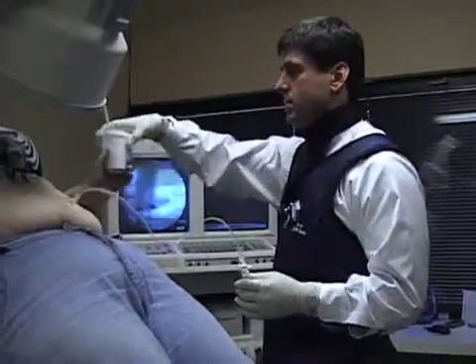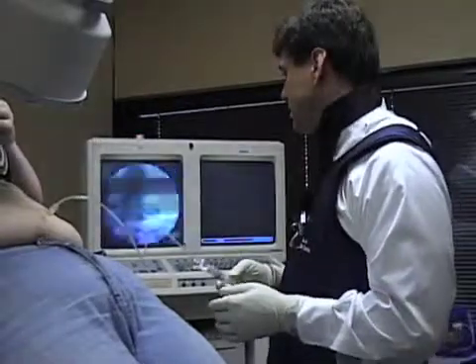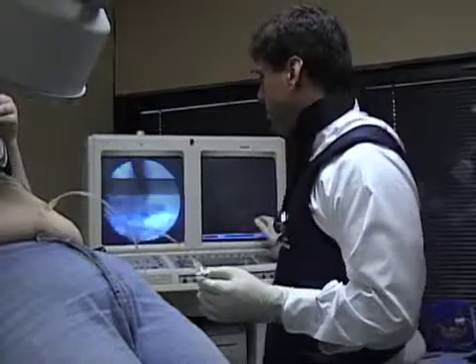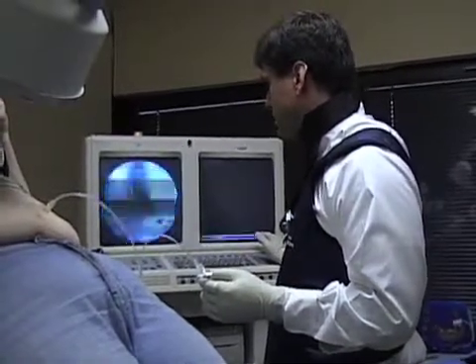This is a very tailored approach to doing the adjustable gastric banding. With some barium — remember to unbend the straw so you don't get it on your shirt. Let's see what this looks like. You can see the band is a little bit flat, but the esophagus is not filled with barium, and this empties very, very nicely.